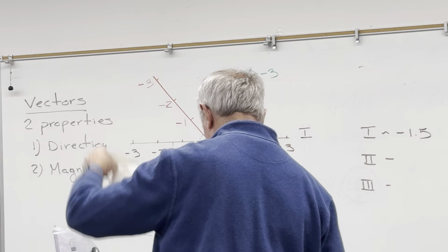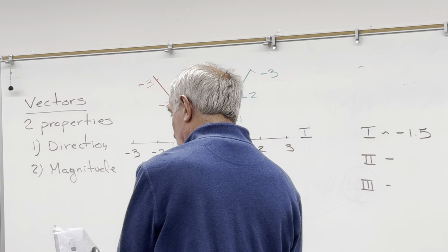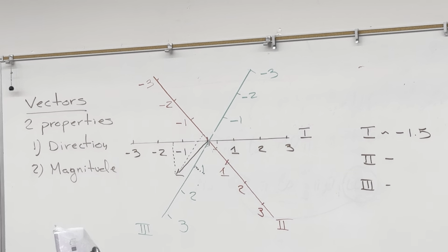We've got alcohol wipes up here. And as I explained last week, you're going to take your subject and simply clean the area on both the left and the right wrists. And then it doesn't make any difference, you're going to take either the left or the right leg, but you're going to take the medial border of the tibia, and that's where you're going to have your third electrode. Everybody with me on that so far?